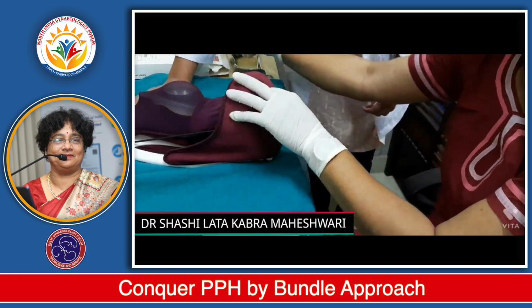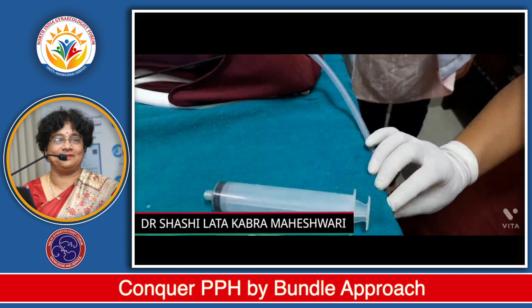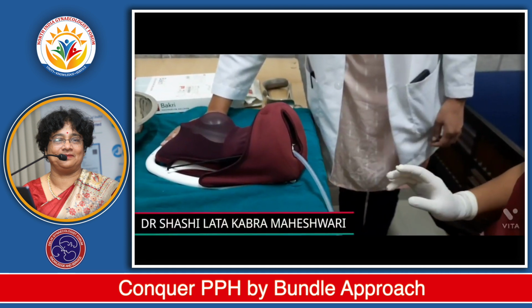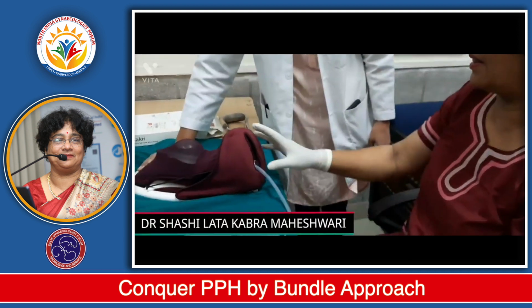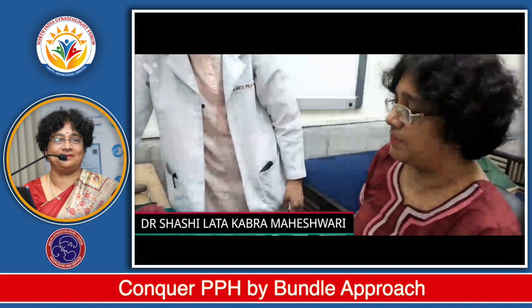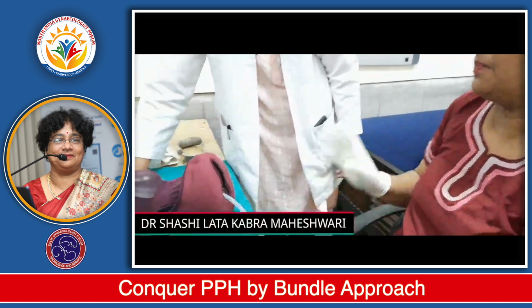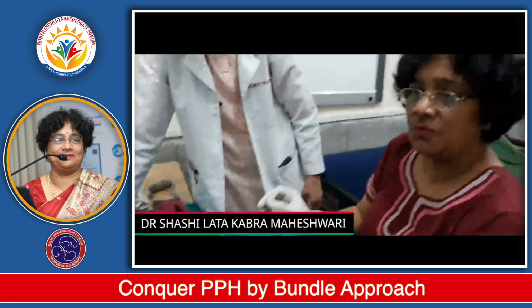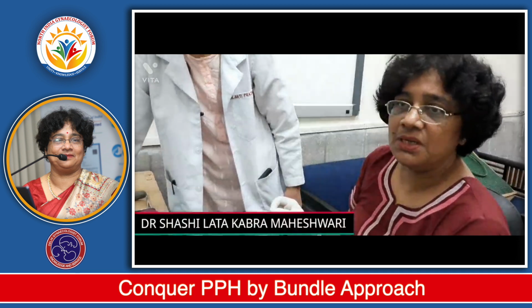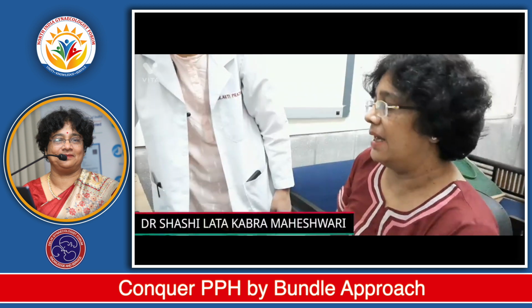And this will be pasted at the thigh of the patient, and the patient's vitals will be monitored. If the bleeding is reduced and the patient's vitals are stable, we will keep this at maximum for 24 hours. But usually after 12 hours, if the patient is stable, then we can remove it gradually. So for removal, we remove 50 ml of fluid gradually at every 1 hour interval, and then we remove it.